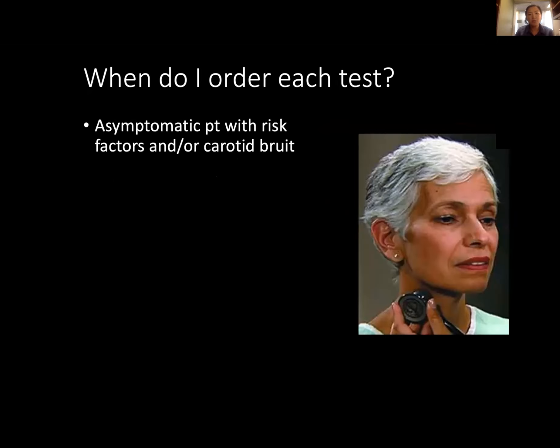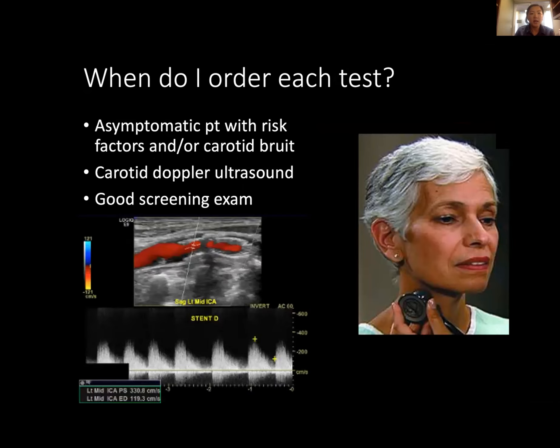For an asymptomatic outpatient with cardiovascular risk factors or a carotid bruit, Doppler ultrasound is a good screening exam. It's non-invasive, requires no contrast, and is not very expensive — advantages over CTA or MRA. Here you can see plaque narrowing the lumen of the carotid artery, and velocity measurements through the internal carotid artery help determine the degree of stenosis.